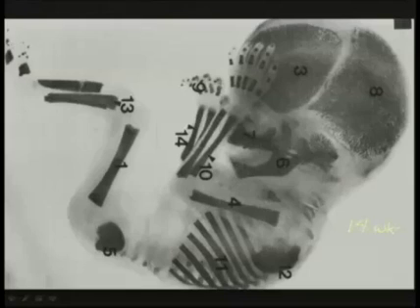And what's impressive about that is that you go from some of the early ossification, and in approximately a month, you get ossification of nearly all the bones of the body. Notice that there is ossification of all the small bones of the hands and the feet, as well as, of course, the major bones of the body.